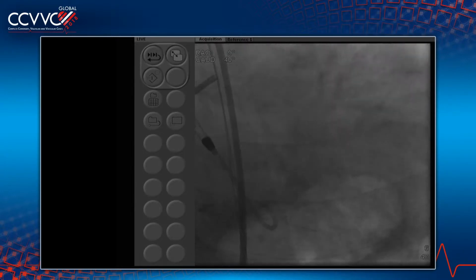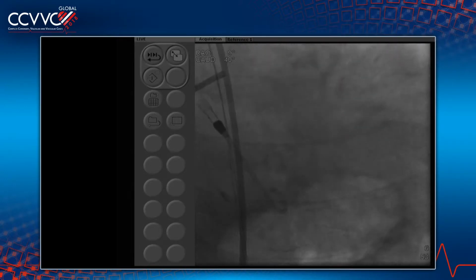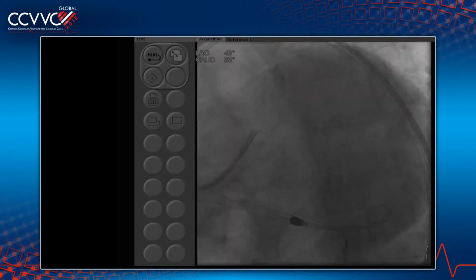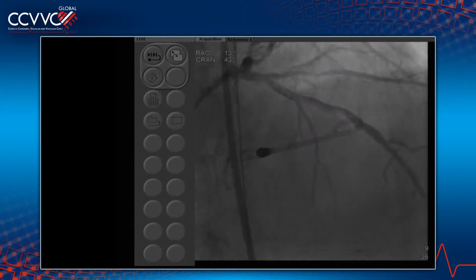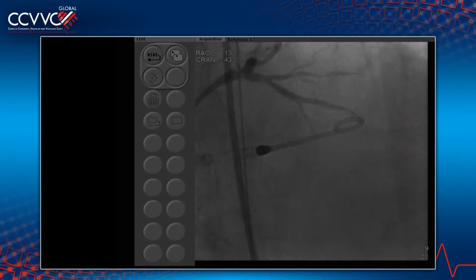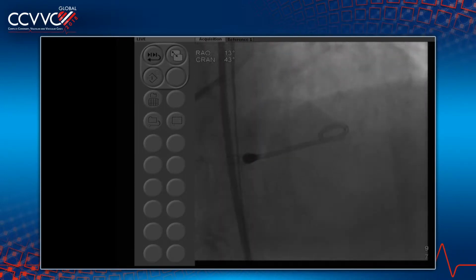You have this left main. We are talking about moderate 60% disease, and significant disease of this large bifurcating OM, which we call OM1, OM2, with moderate calcium. This is the caudal picture of the left main, but more important is the LAD, maybe 50-60% LAD, with significant disease of the diagonal. Incredible case, difficult, 3-vessel disease.